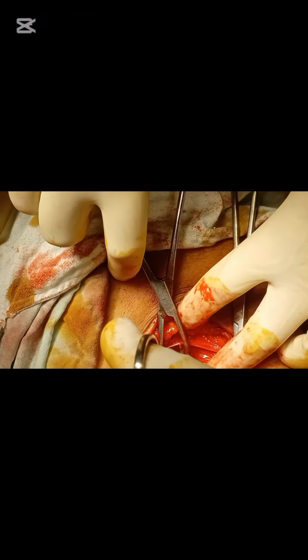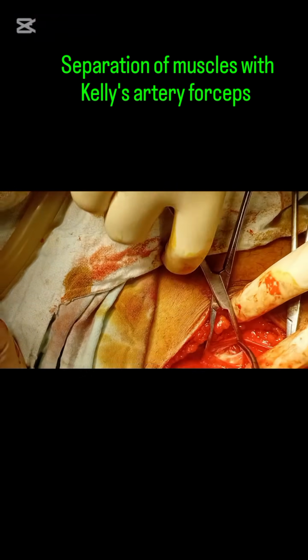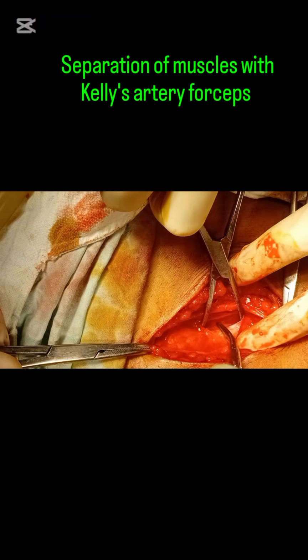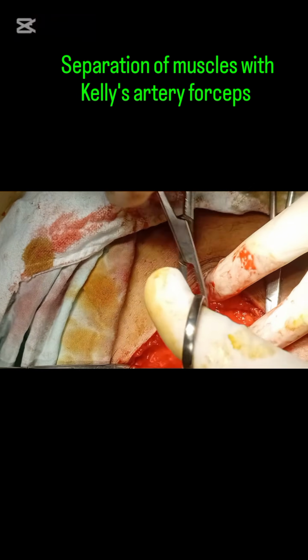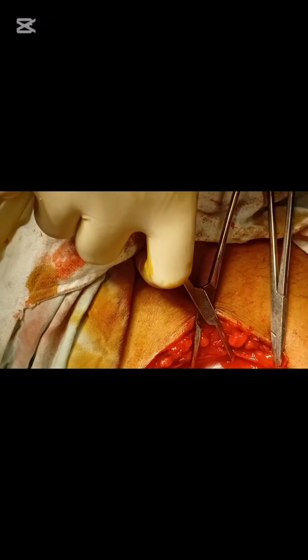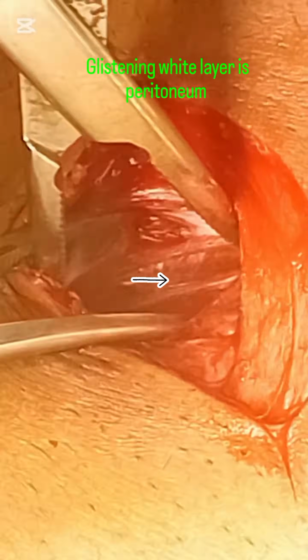Now we will dissect the muscles by deepening and separating with one artery forceps, opening it vertically, then inserting another artery forceps and opening it horizontally. We will go deeper and deeper until we see a glistening layer. You can see here a glistening layer. It is actually the peritoneum.